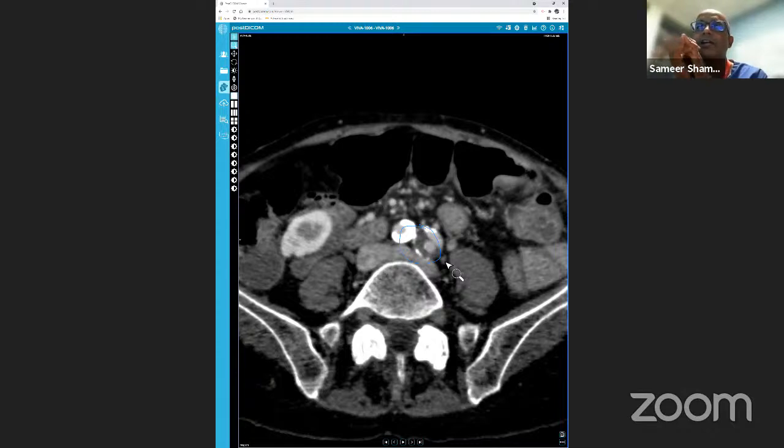Talk through the right observations. Talk about important negatives, which is also important in the exams. Then come to a reasonable set of differential diagnoses and tell what you think is the actual diagnosis. And then talk about further management. So don't stop before you talk through the case until the point of further management, which I was really impressed with in your VIVA. In this particular case, yes, it's a left-sided oncocytoma. So that was correctly picked.